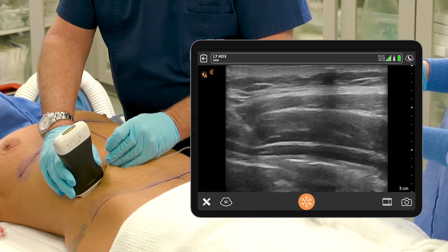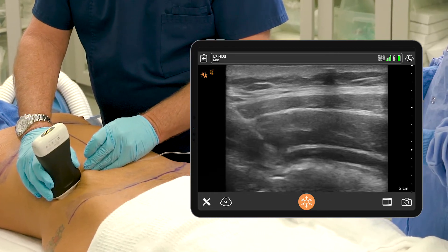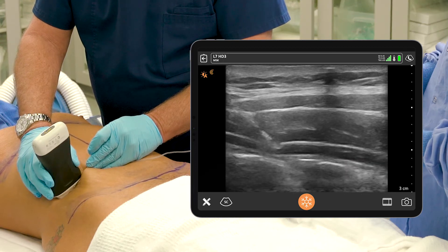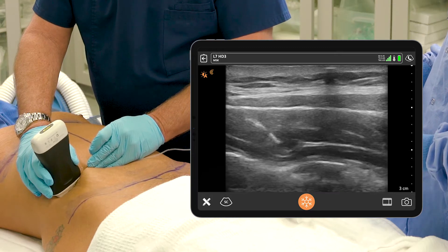I'm going to find the needle. I'm already through the internal oblique because she's so thin. I can see that little plane — I think I'm in. Give me a test dose. Perfect. Switch over.